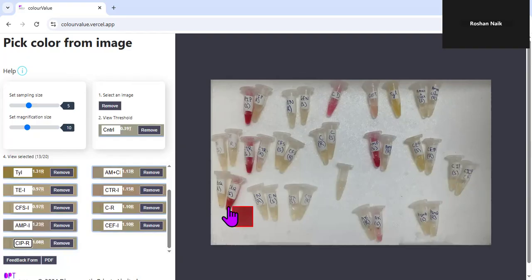We have CQ here. In the lower concentration it is showing dark color, but when you increase the concentration, it decreases. So CQ is again an intermediate phenotype. And you can see this one is among the best, 0.87, CQ, susceptible. Enrofloxacin, EN, is again good, susceptible. Then we have CTX. CTX is also good; 0.95 is the limit. It is good, susceptible.